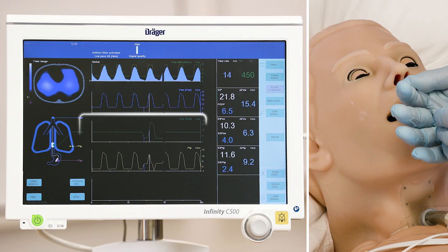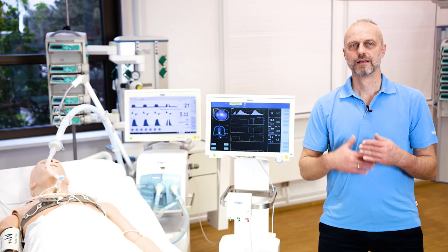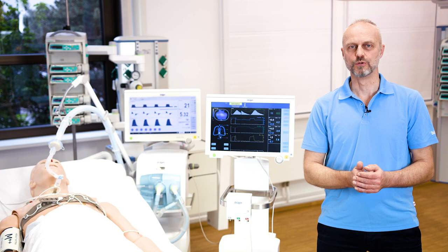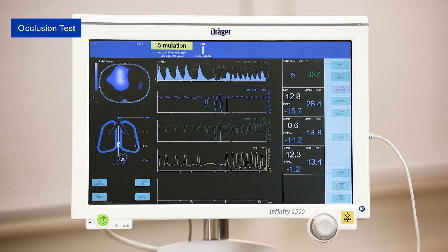Now we slowly withdraw the catheter until the cardiac oscillation becomes present in the esophageal pressure waveform. Now it's time to check the proper balloon position. We conduct an end-expiratory occlusion maneuver and open the dialogue occlusion test.